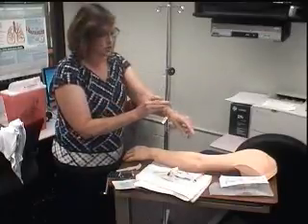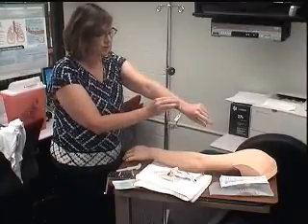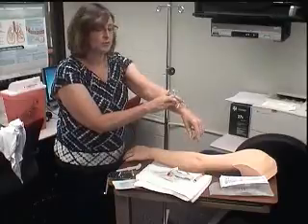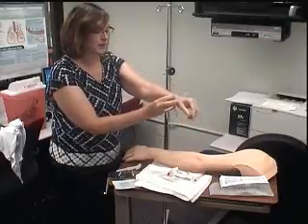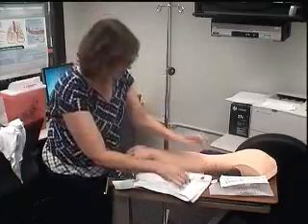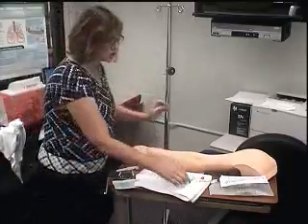Like I said, I'm going to use the extension tubing because that way I'm not constantly moving this part around that's in the arm. I'm moving around when I'm trying to flush, and I'm moving the very end around right here instead of this that's close inside the arm. I'm going to tape that down real well. So I've got my saline lock with extension tubing.